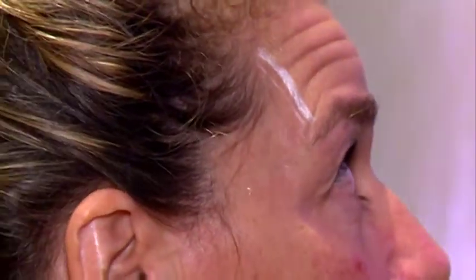So my task for her today was, we can also do the temples. So what anatomy do we have to think about? This is the temporal fusion line, so crista temporalis. Guys, can you see, or do you want the lights down a bit? Can we turn the lights down in the room a little bit so everyone can see, because there's a bit of a reflex. Yeah, perfect, thank you.